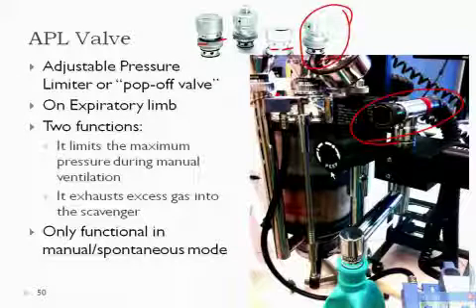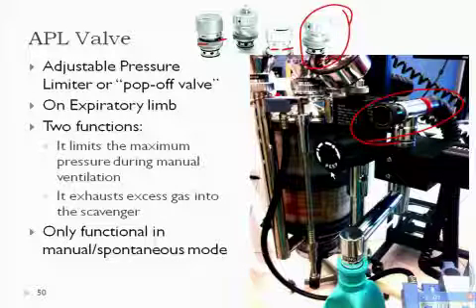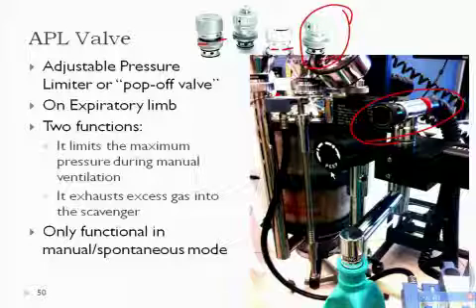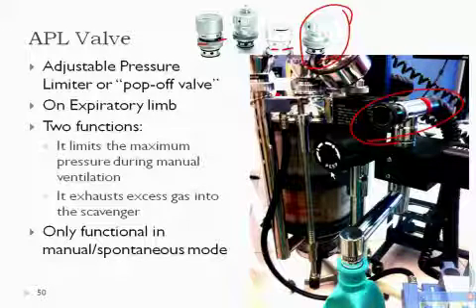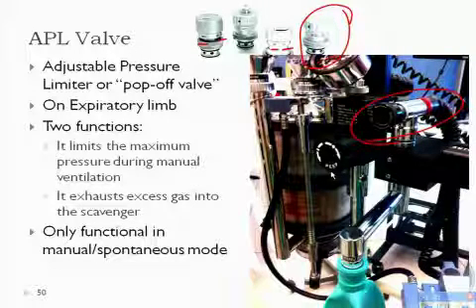Okay, so whenever we're getting people back breathing, they like to breathe against some sort of pressure because we all have an intrinsic PEEP. You know, our intrinsic PEEP is 3 to 5. We breathe against our glottis. That's why we don't develop pulmonary edema all the time. We have a negative pressure system. We like to breathe against pressure. So when you have a tracheal tube in and your epiglottis is no longer working because it's open and you have an open tube, we have to create a system of pressure.